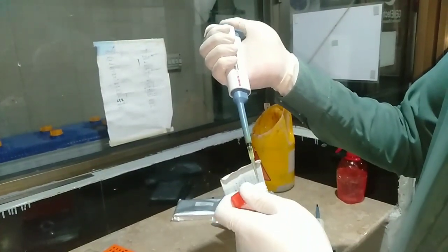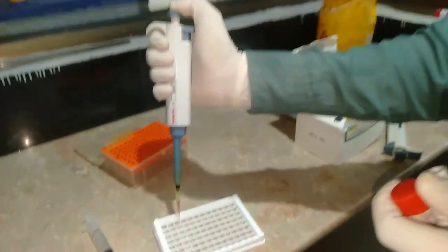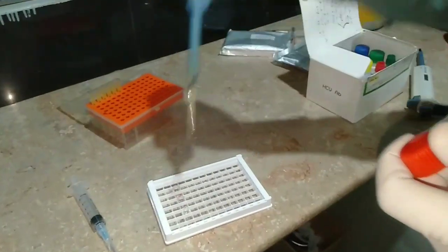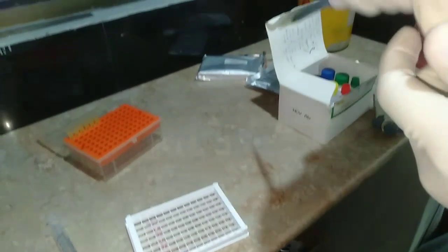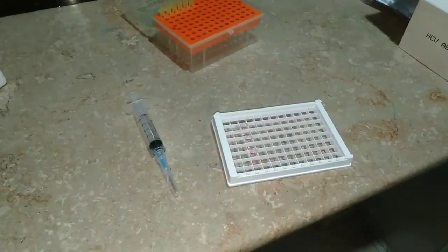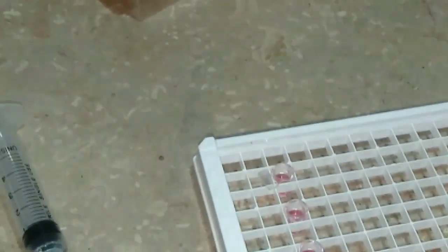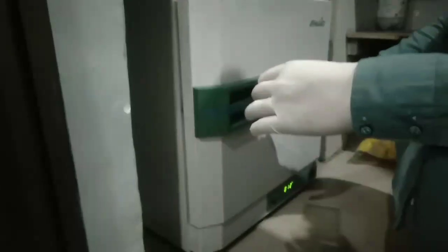After washing, we load the conjugate. We take 100 microliters of the HCV AB conjugate and load it into all three wells respectively — first into the first well, then into the second, and finally into the third well, as you can see.